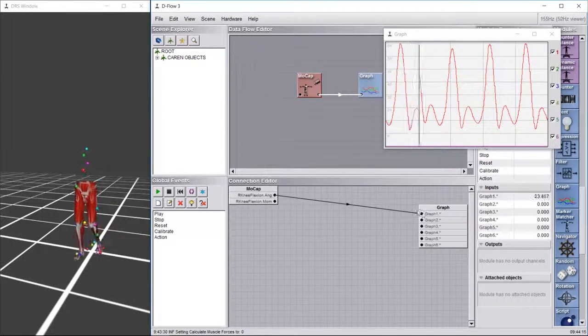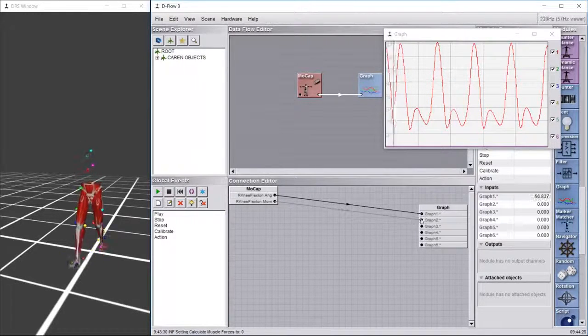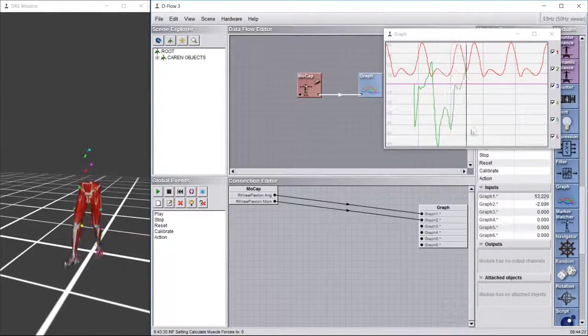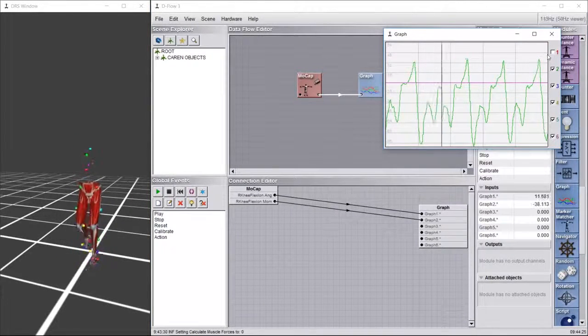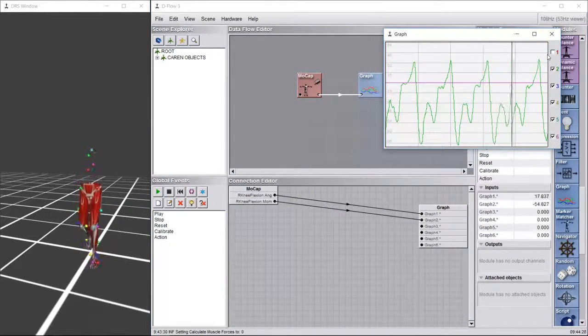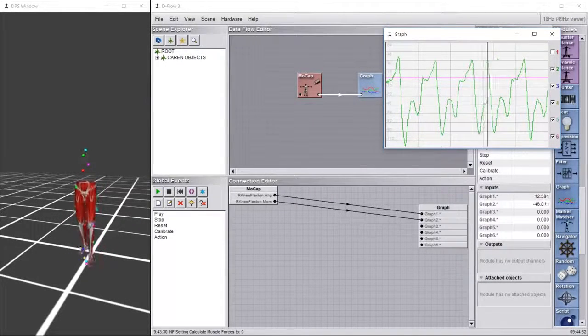And here you'll see a familiar knee flexion angle graph. And then the green one is the knee joint moment graph. So that's how easy it is to use the HBM in real time and get real-time information out. I will go back to the PowerPoint here.